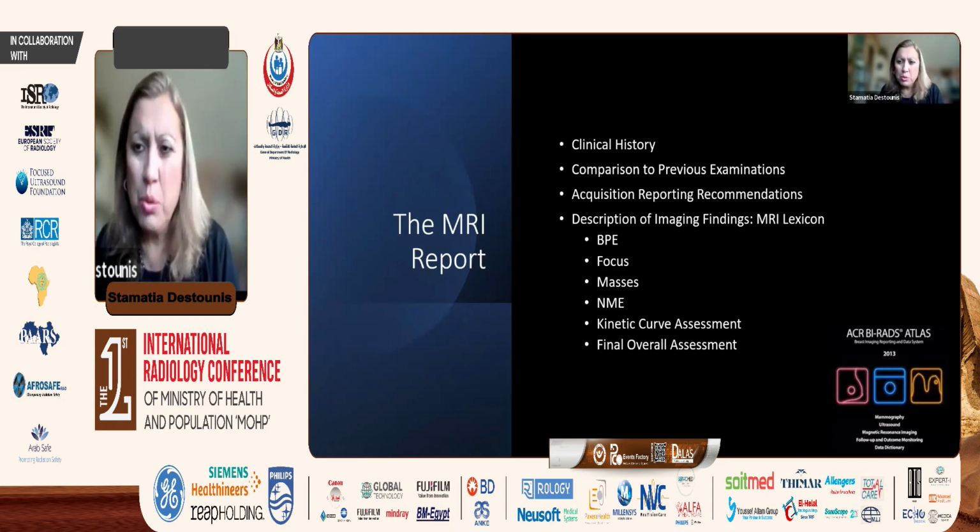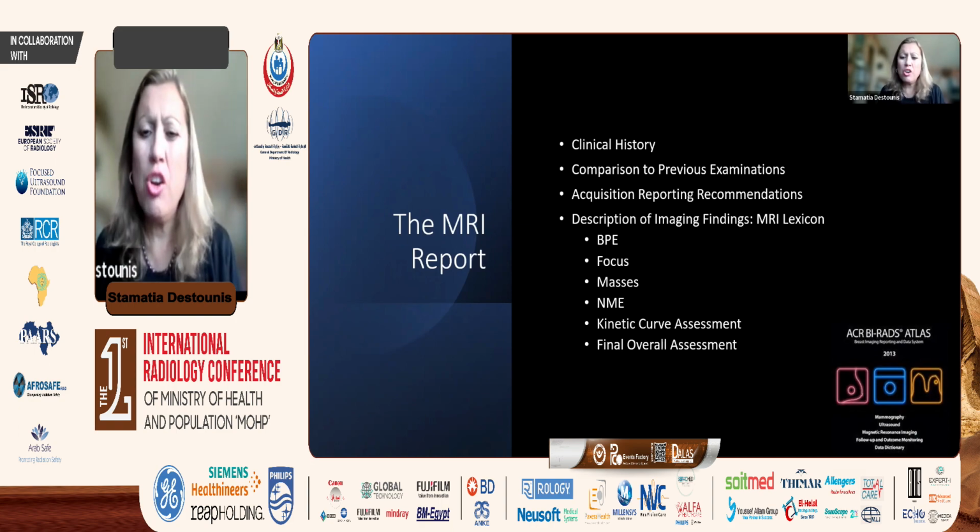We are actively working on the 6th edition, and that'll be out sometime next year, but we don't have that out yet. We're very excited about changes, but at this point, we have the 5th edition, and we're going to be discussing background parenchymal enhancement, foci versus masses, non-mass enhancement, kinetic curve assessment, and the final overall assessment in our reporting.